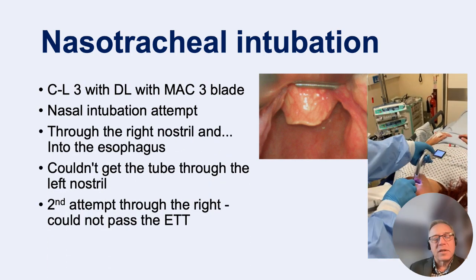Unfortunately, they were not as successful. They tried through the right nostril and ended up in the esophagus. They couldn't get the tube through the left nostril at all. The second attempt through the right nostril couldn't pass the endotracheal tube at all.